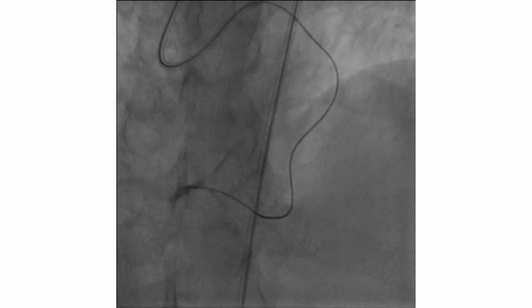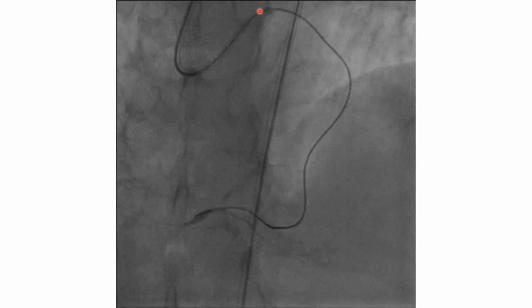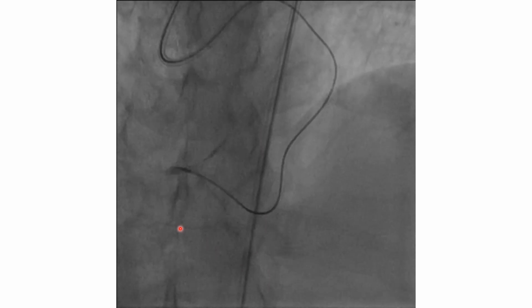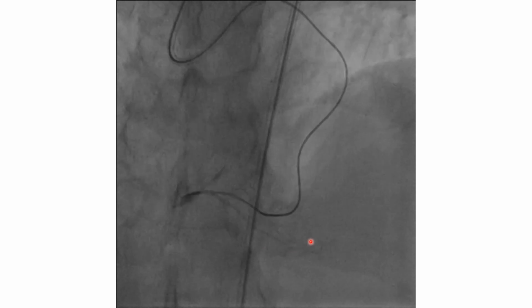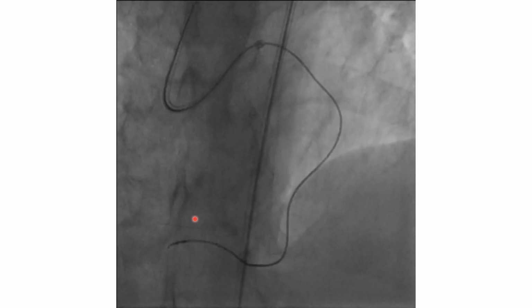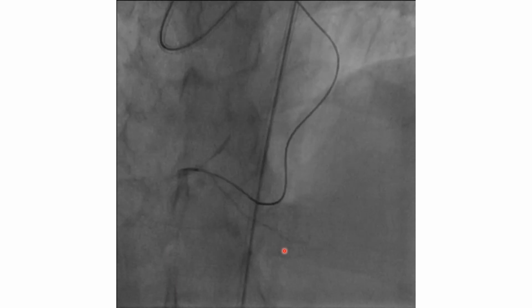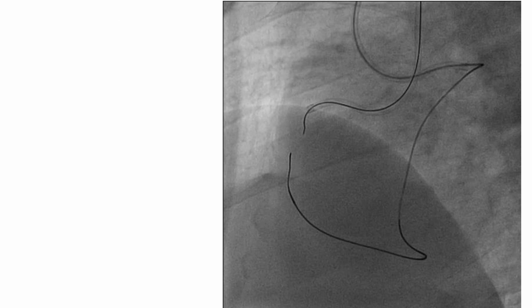So we changed the guiding catheter into the AL, Amplatz left, and changed the microcatheter to the Corsair. And this should have been done actually from the beginning. We crossed to the distal RCA and did tip injection. Then the Corsair microcatheter was pushed up to the distal part. And now, what is the next step?